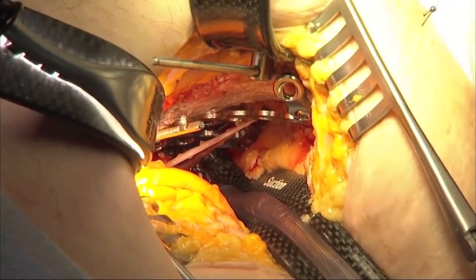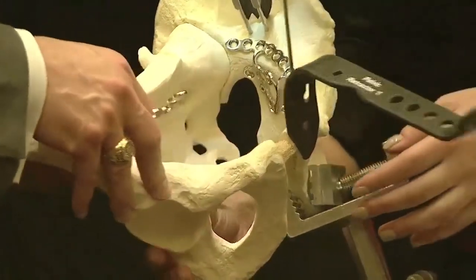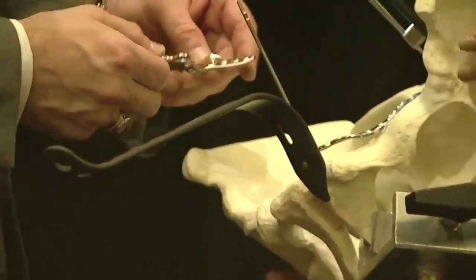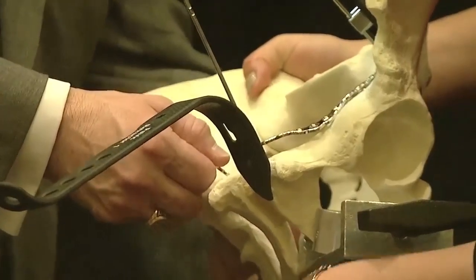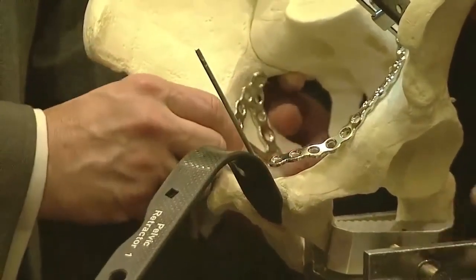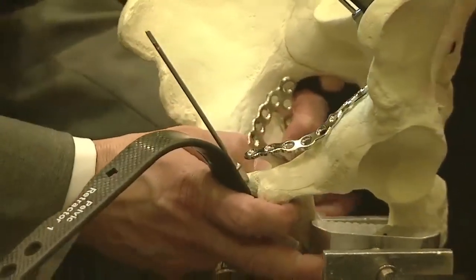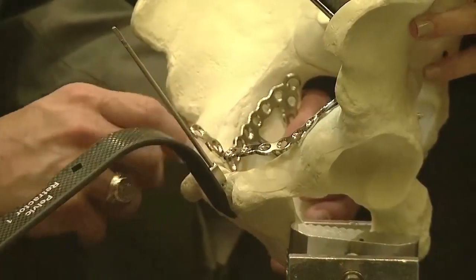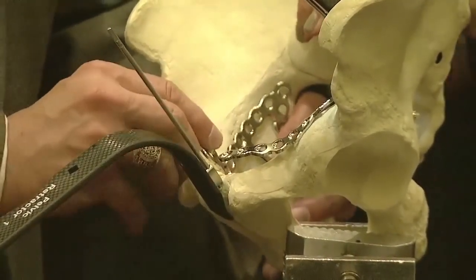Thanks, Claude. That's fantastic. I've got the pelvis turned around here. Let's see if I can change it so you can see the plate that he just put in on the sawbone. I'll try to hold it for you just so you can get the idea. So this is the infrapectineal plate that Claude just put in. You can get the idea where it's sitting. And then out in front is this tab that nicely bends over the top of the pubic body.